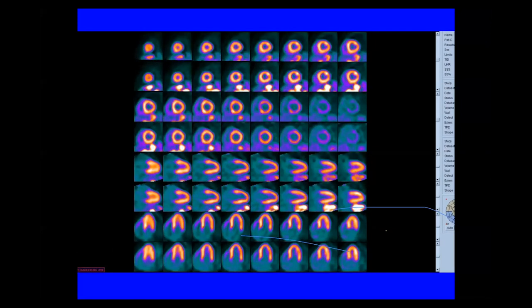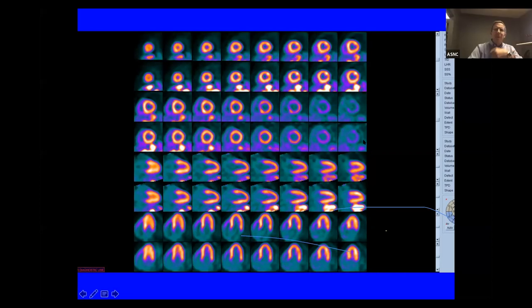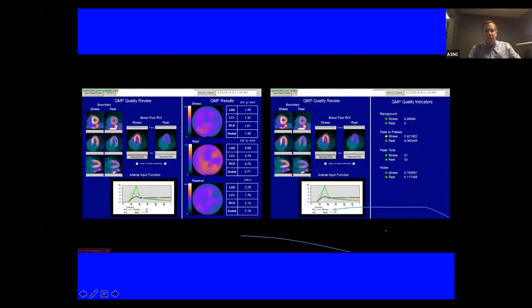So looking at the perfusion images, the septum certainly is more prominent even in the basal slices, where you'd expect membranous drop off. You can see the RV and the RV uptake. And there's definitely gut uptake down here, but otherwise. And the papillary muscle is a bit prominent also. Yeah. His flows were normal.